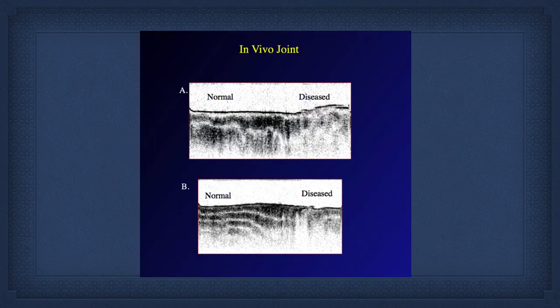Except we're the only group that works in what's called single channel PS-OCT because we tried dual channel. Dual channel gives you absolute numbers of polarization. So it will give you the birefringence in here. But first of all, we never found a point where we actually needed it. And secondly, it just increases the opportunity for errors.